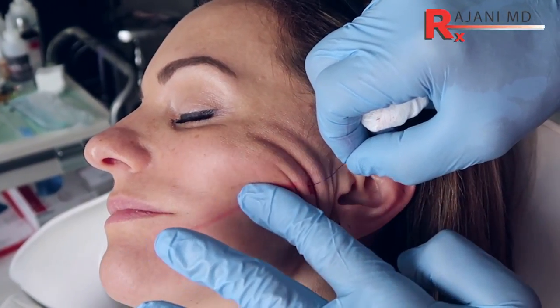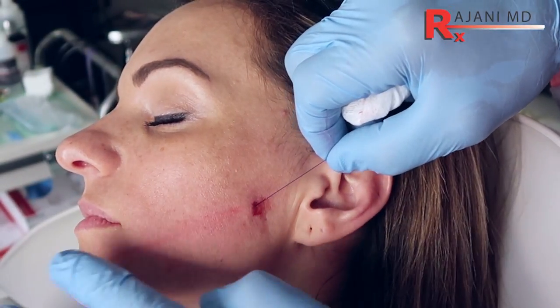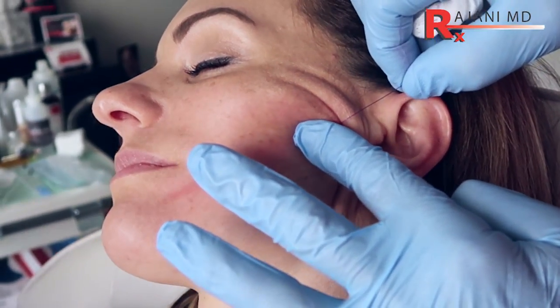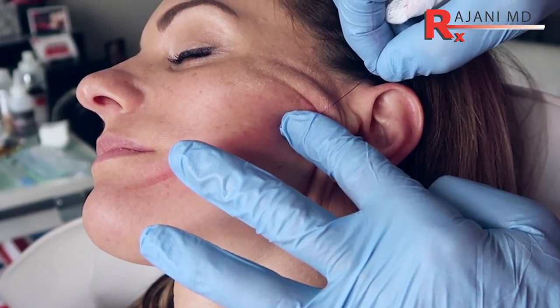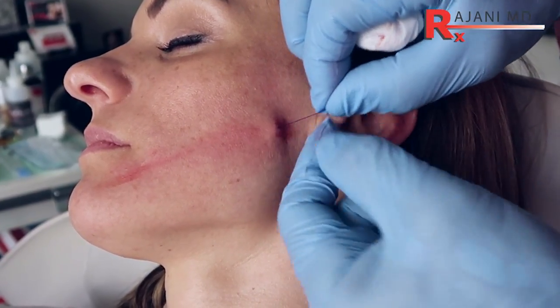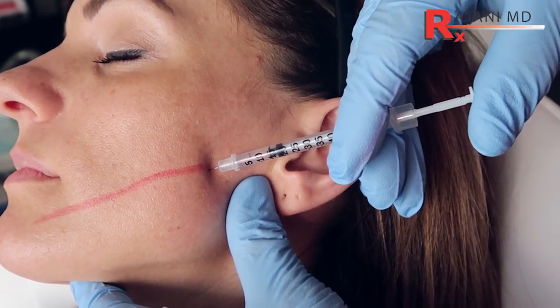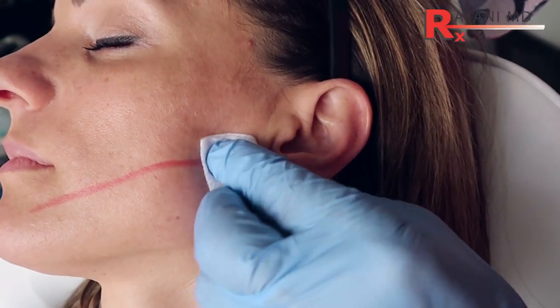Most of all, it's a lot more comfortable for patients. Doing facial threads, there are two areas that are somewhat tender that we all shudder a little bit as the cannula gets down there — seeing how the patient is going to react, whether they're stoic with no pain or whether the pain is difficult to overcome. Those areas are the nasal labial fold and the melomental fold down by the edge of the mouth. Sometimes nitrous helps a little bit, numbing with a nerve block helps a little bit but not totally. The number one way is adding a bit of lidocaine down that track — maybe 0.5 cc's, not a lot — and then employing the thread. Not too much fluid, because the thread will not grab. Used in that way, if you need to use lidocaine or numbing at all — some people do fine without it.